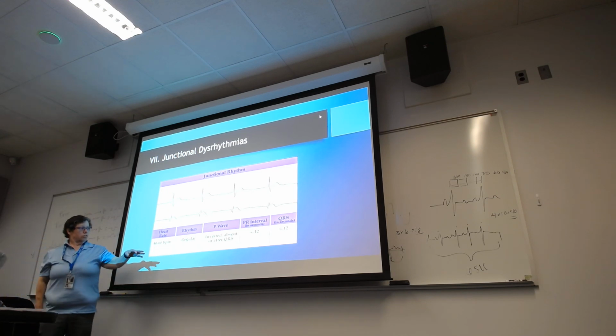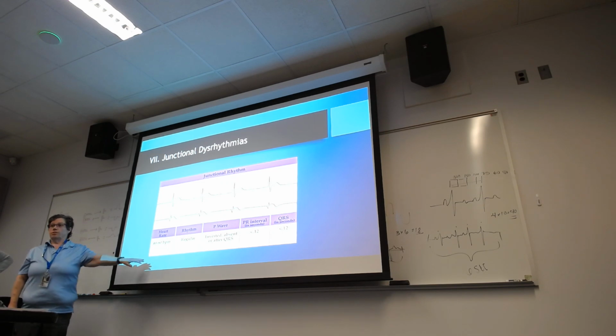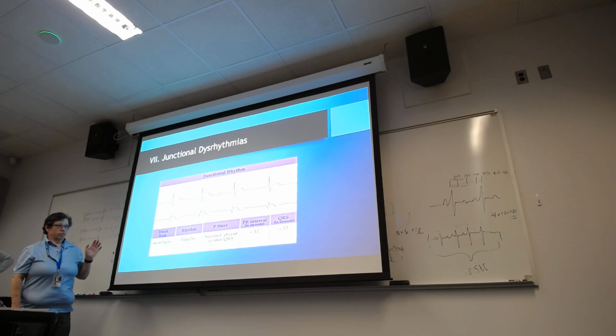Notice on all these slides, there are these on the bottom, right? They're there for a reason. You have to approach reading EKGs with a system, okay? Because if you don't, you're gonna miss it. You're gonna miss stuff, okay?